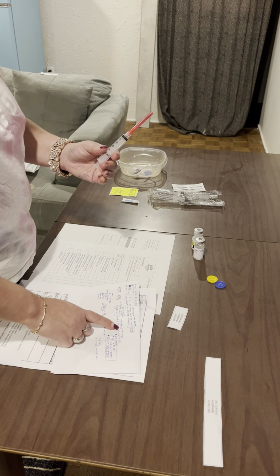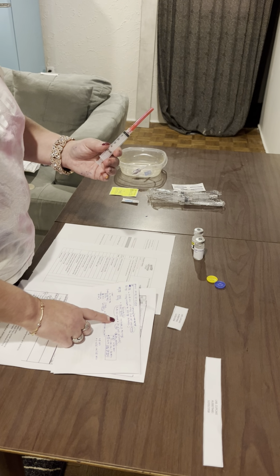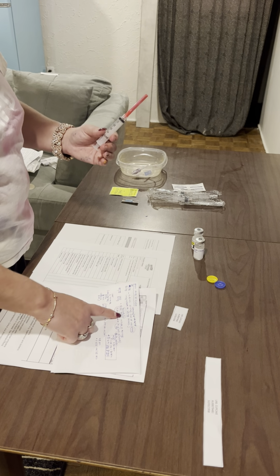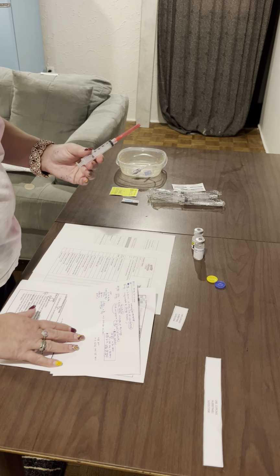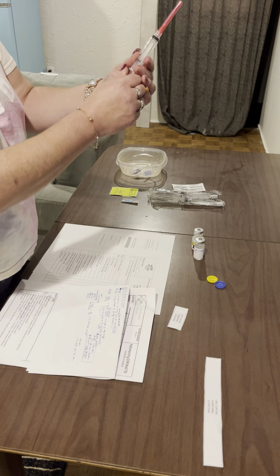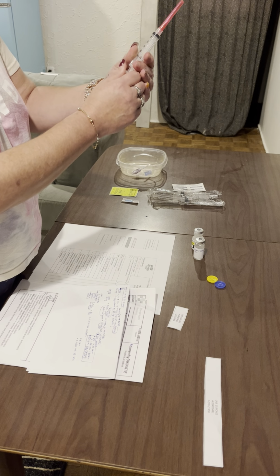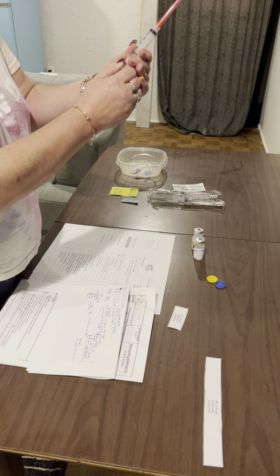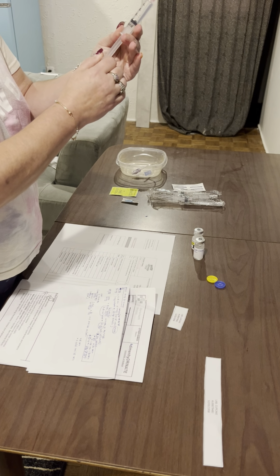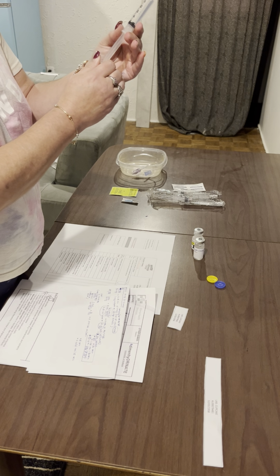So we're checking our med math totals to ensure, and sure enough, it says we should be drawing up 4.5 mils as per our med math. So we're just double checking that. Yes, that's all good. Wonderful. And so we're going to draw back 4.5 air first. So we will draw back 4.5 air.